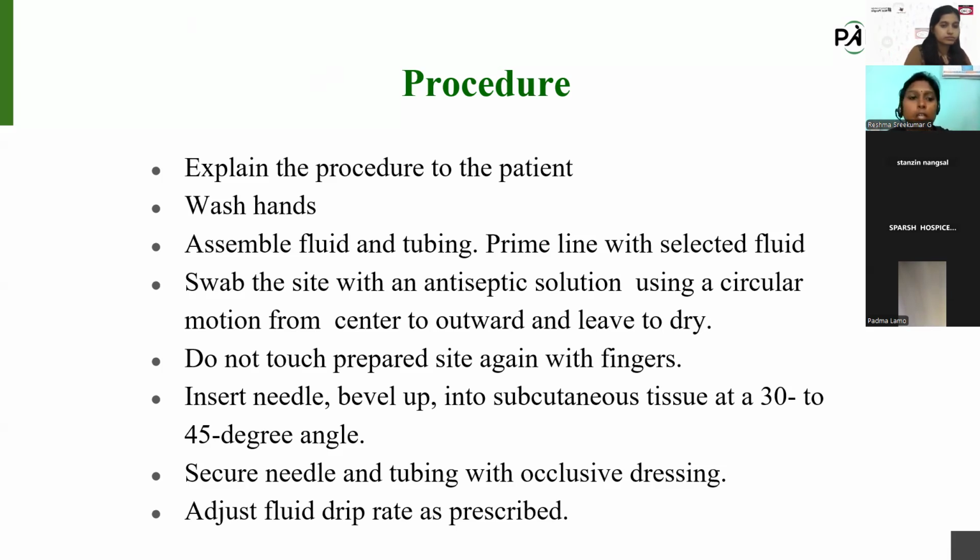This is how we are giving subcutaneous fluids. We are introducing subcutaneous fluids.